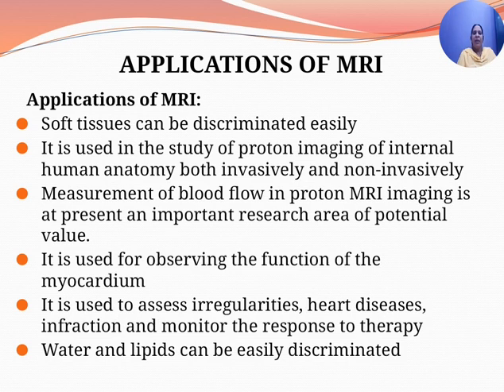Then we have the other areas where MRI can be used. There are several areas of diagnosis. Water and lipids can be discriminated easily using MRI, and it can be used for diagnosis of musculoskeletal pathologies of knee and hip and shoulders.